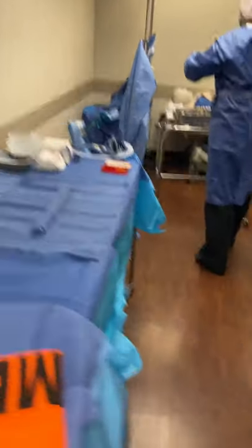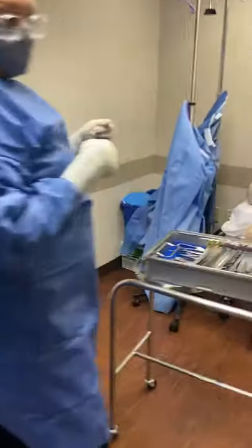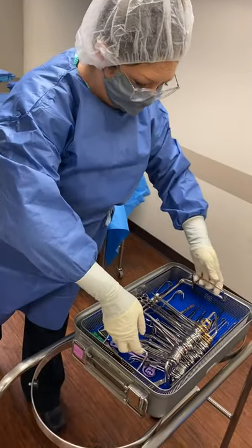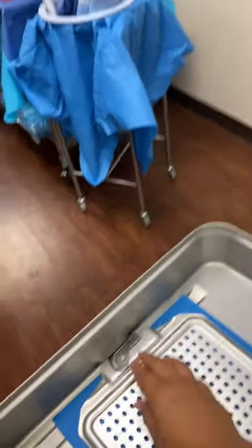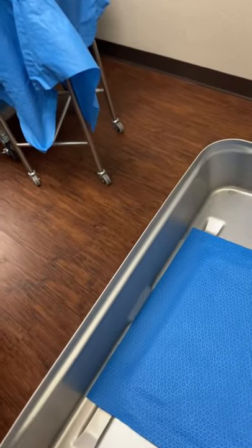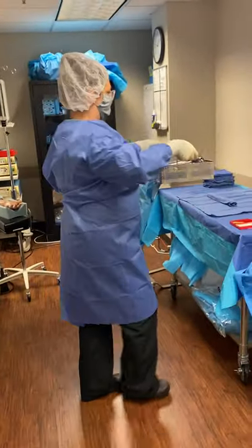So in here is my tray of instruments. I'll wait for my circulator to come up so she can help me with the indicators. So far I can see that they're great, and now she's going to look at the filters. That's my last checkpoint to make sure that everything is okay with this. Everything is good — that tray of instruments is perfect.